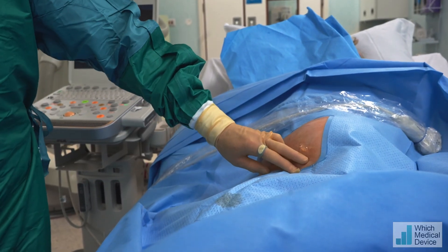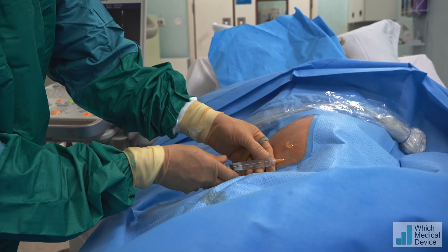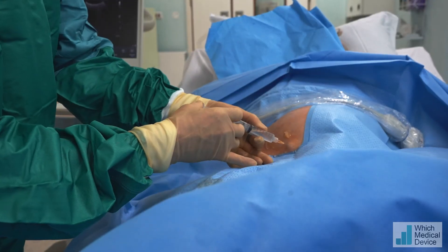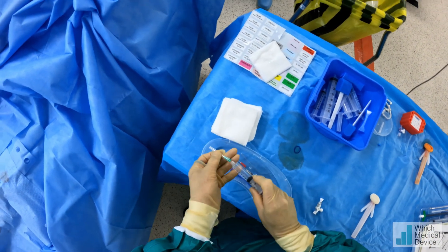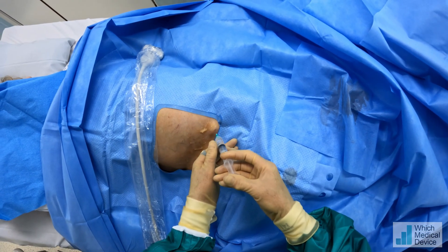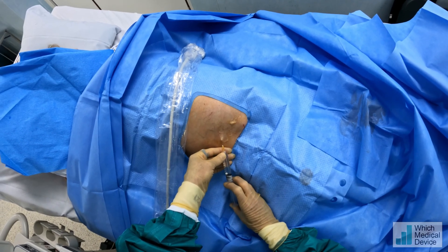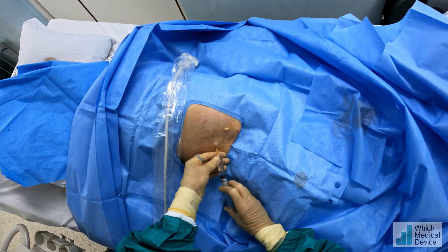I'm going to put some local anaesthetic into your skin first. This is going to be a sharp scratch coming up now and it might sting a little bit. Now I'm going to anaesthetise all the way through into the peritoneum — we've got ascites back there, so all the way through. Just anaesthetising a bit more skin here because this is where we're going to have a suture to fix into place until the cuff has adhered.